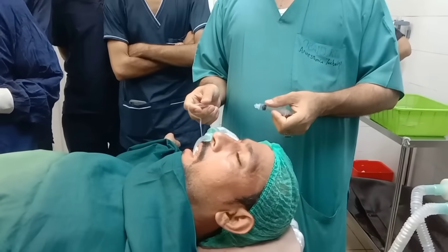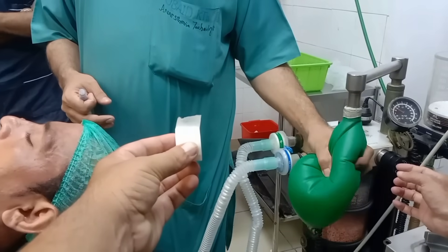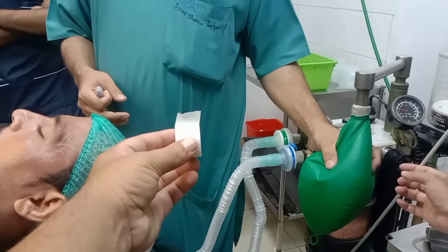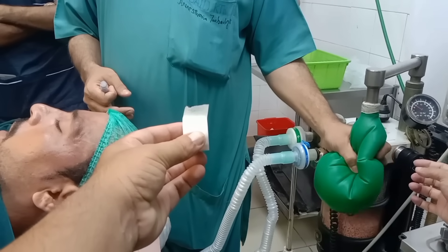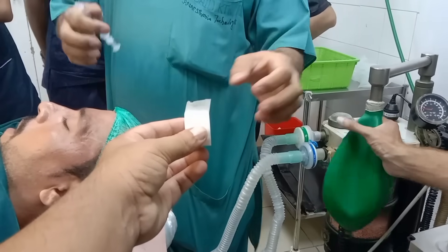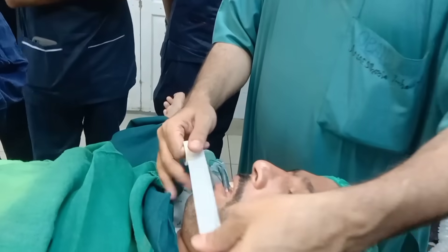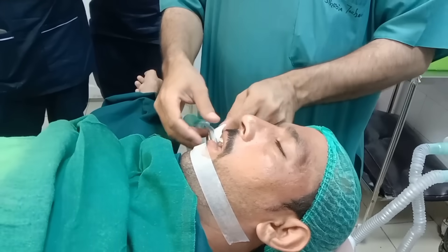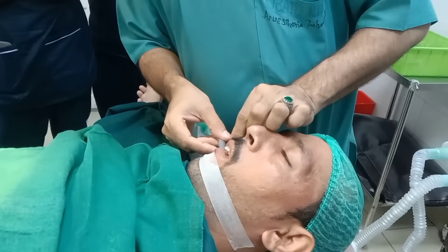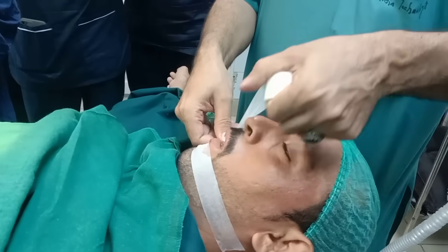Maintenance of anesthesia during surgery. After intubation, I connected the patient to the anesthesia machine and started inhalational anesthesia with oxygen and anesthetic gases to maintain anesthesia throughout the procedure. During the surgery, I continuously monitored the patient's vital signs including heart rate, blood pressure, oxygen saturation, and ECG. IV fluids were continued and medications were adjusted as required.